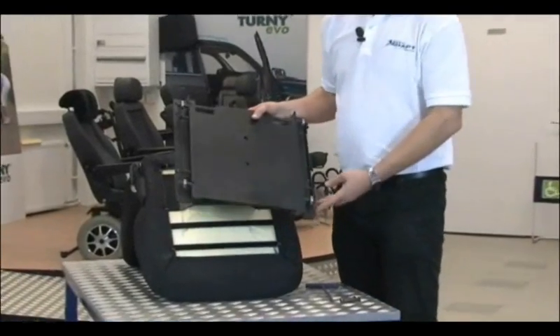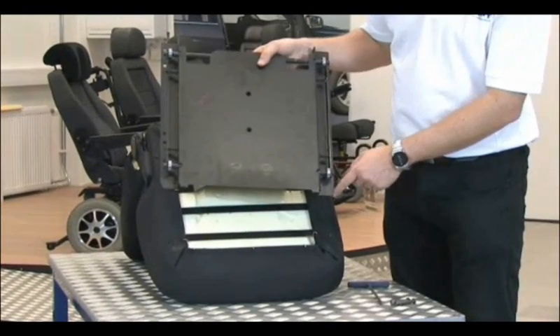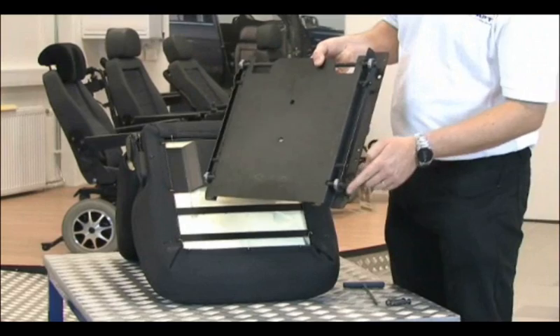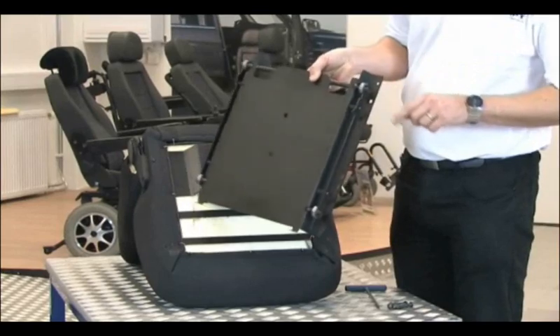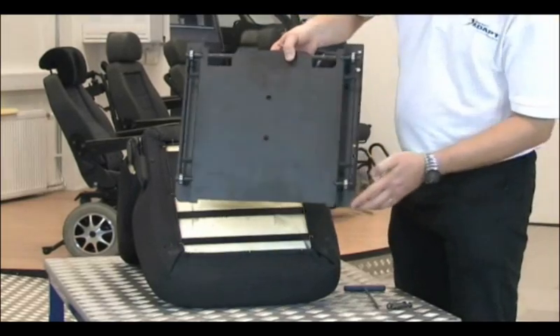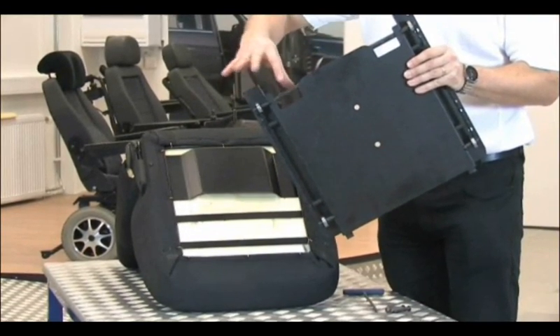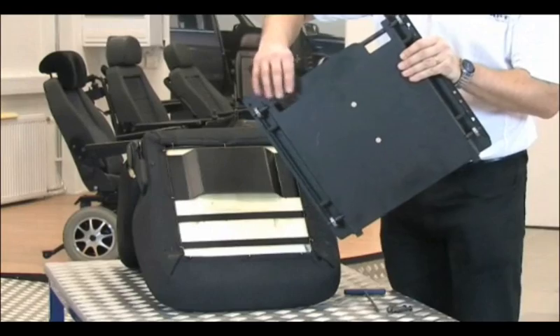And just to give you a hint about how it's going to be installed, you probably can see that it's a little bit shaved off in the corners here. That is front. You see, on the other end they are squarish, very 90 degrees angled. But on this side here it's a little bit shaved off. That is front. You can also imagine the two locks sitting at the rear grabbing onto the axle here. In the front area it's not possible to lock it on. So of course this is rear.